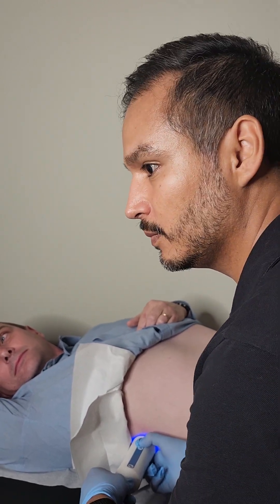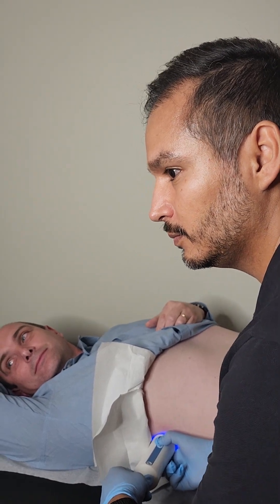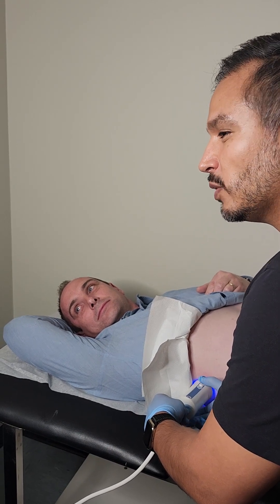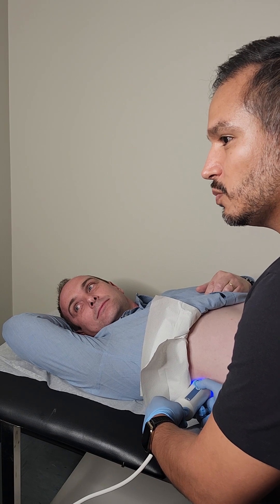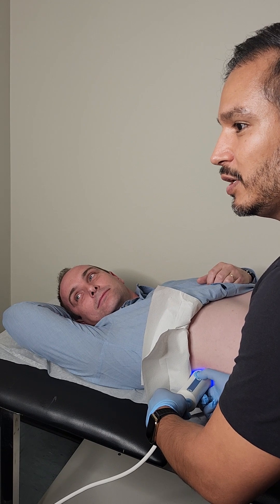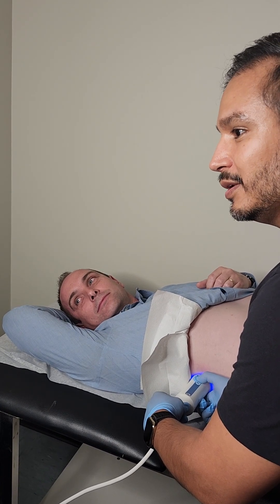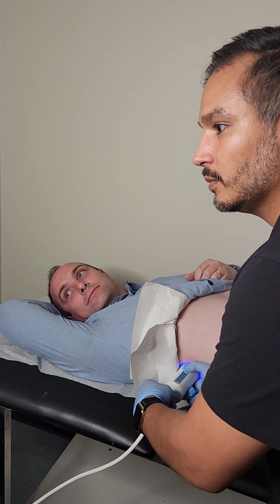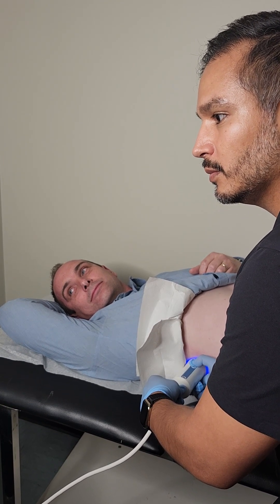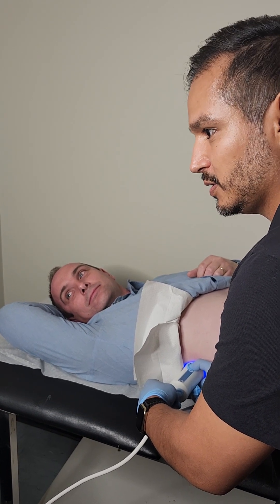All right, so let's do a FibroScan in the name of liver health. David, what are you doing right now? Right now I am pulsating — the unit actually sends a frequency wave that bounces back to determine how stiff the liver is. We're always trying to find the lowest number possible because that gives us the most accurate reading, and I'm using the monitor to make sure I'm not reading from the rib, the lung, or an artery. And just for Brad's security and HIPAA compliance, we will not be showing the screen, but David, you're doing a FibroScan right now, right? Yes I am.